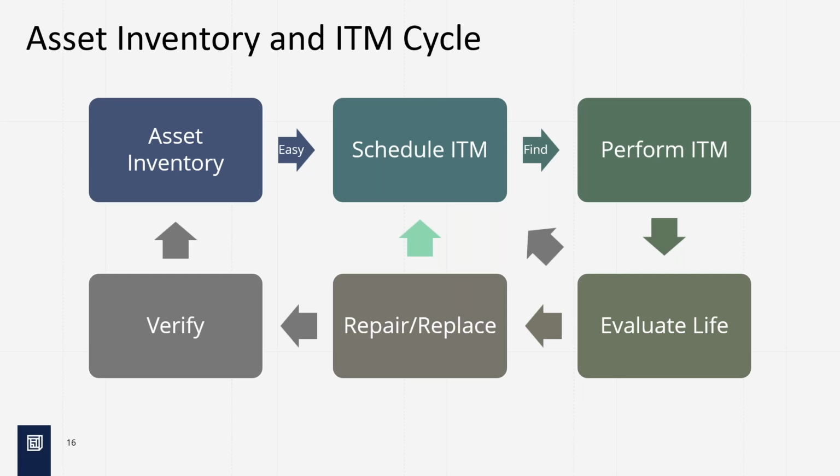Any vendors in here, by the way, that are repairing equipment, not from the hospital side, but they're sending it to you to get repaired? So then, just verify, hey, is this still in my inventory? There's also a component of going back up and looking for new assets coming in, and you're going through that process. So it's like the row, row, row your boat song. You start the song and then someone else starts it later on. We would sing it, but we're not going to do that.